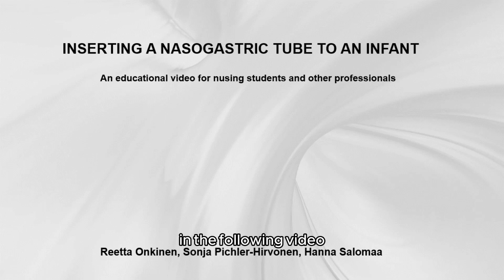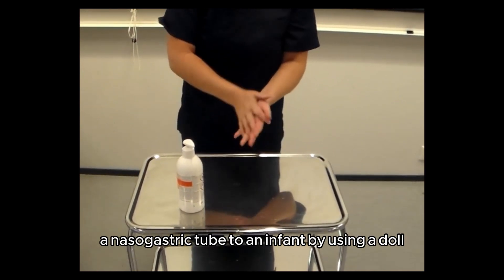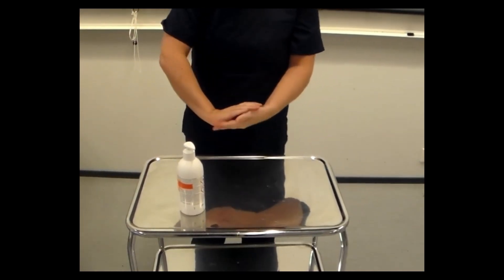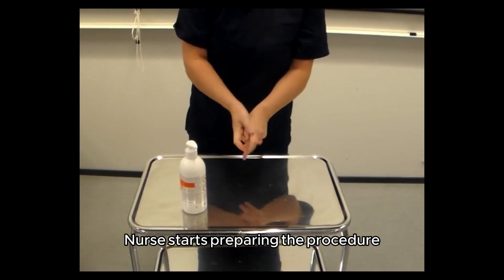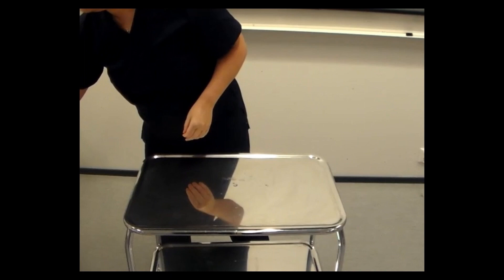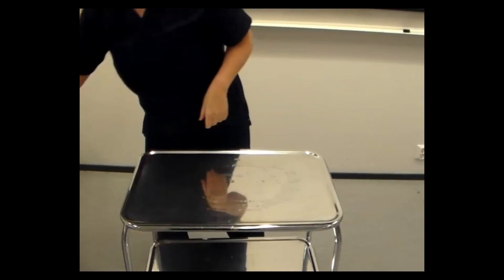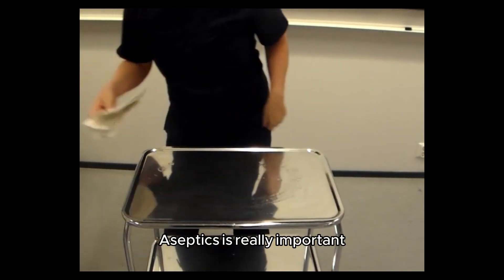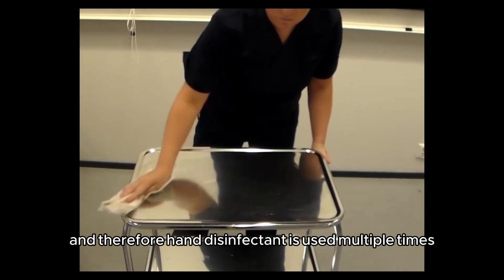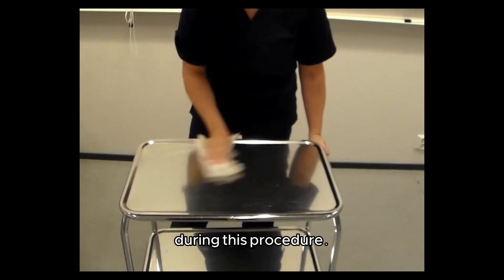In the following video we will show how to insert a nasogastric tube to an infant by using a doll. The nurse starts preparing the procedure by disinfecting hands and also the table where all the needed equipment is gathered. Aseptics is really important and therefore hand disinfectant is used multiple times during this procedure.